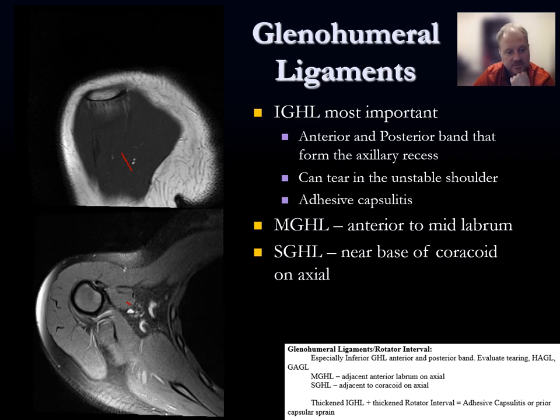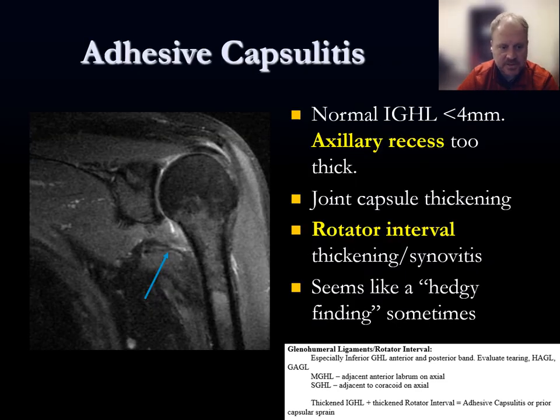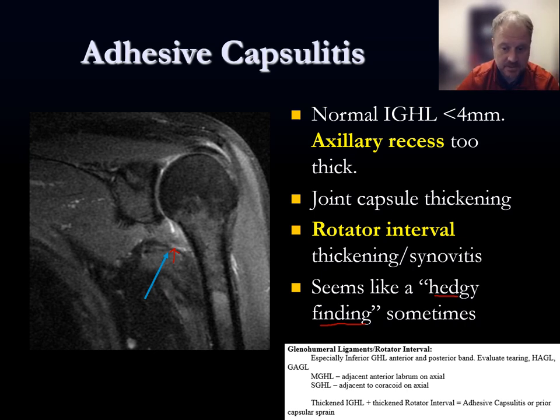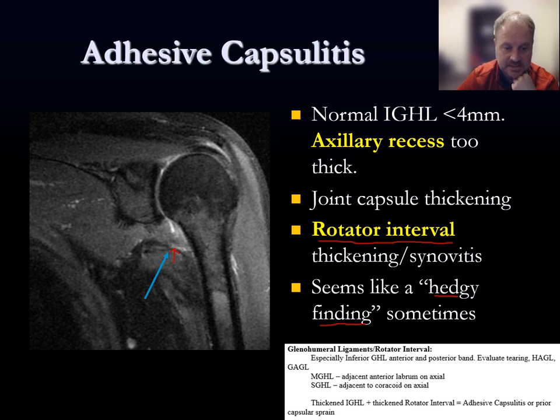Adhesive capsulitis: the inferior glenohumeral ligament normally looks like a thin, dark structure, but in adhesive capsulitis it appears thick and T2 hyperintense on coronal fat-saturated images. Additionally look at the rotator interval — if you see intermediate-density synovitis and thickening there, those are the two areas that support this diagnosis. Adhesive capsulitis is a clinical diagnosis, but the imaging findings of thickening and synovitis in the axillary recess and rotator interval support it.